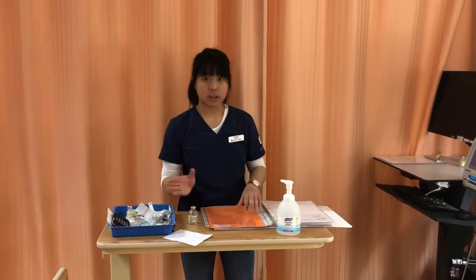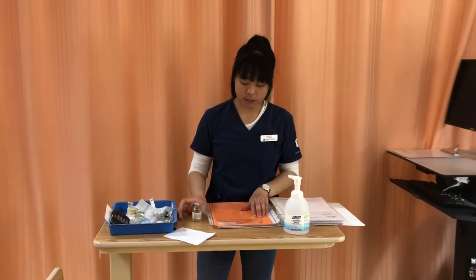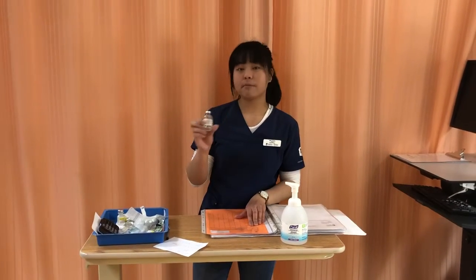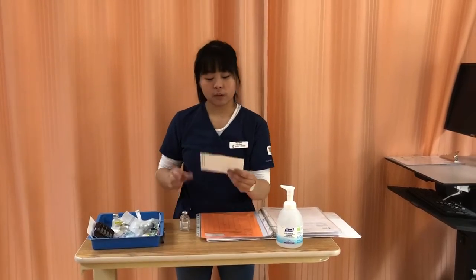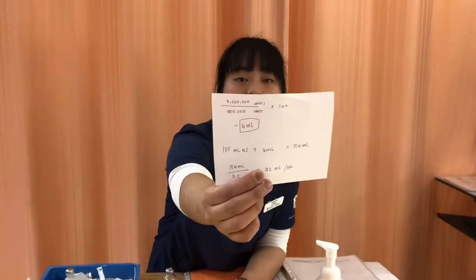So I'm just going to compare that again. I have the right patient, Frida Fritz, Penicillin G Sodium, and this is Penicillin G Sodium, so that's the right medication. And I have 3 million units as my order, and I have a 5 million unit vial here. I already got my math calculation ready here. So after reconstitution, I will be needing 6 mL of medication, and that will be the right dose.